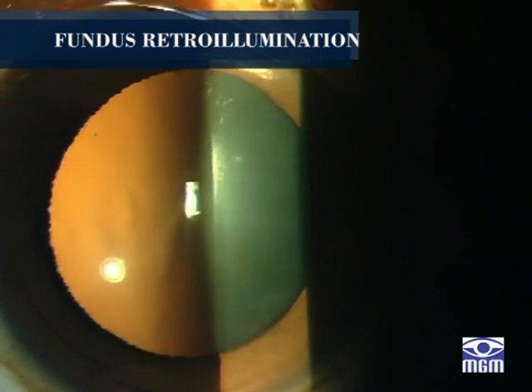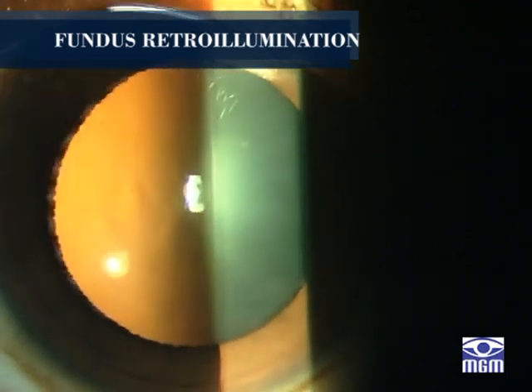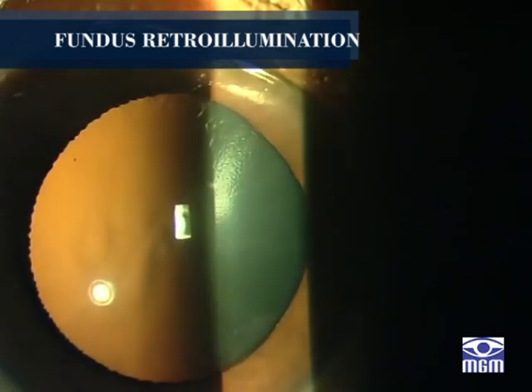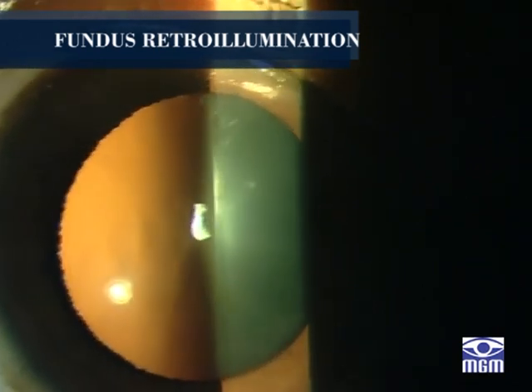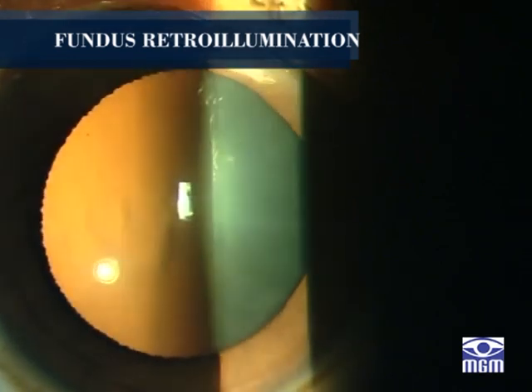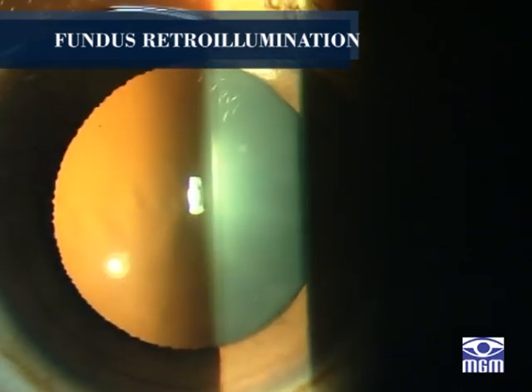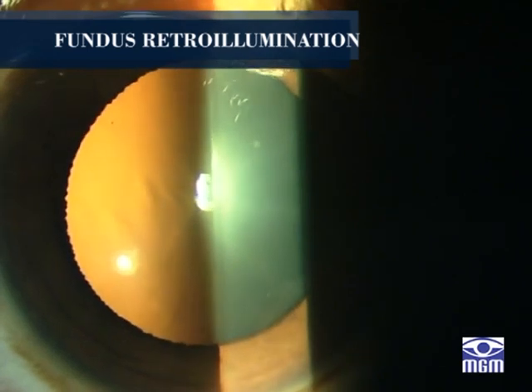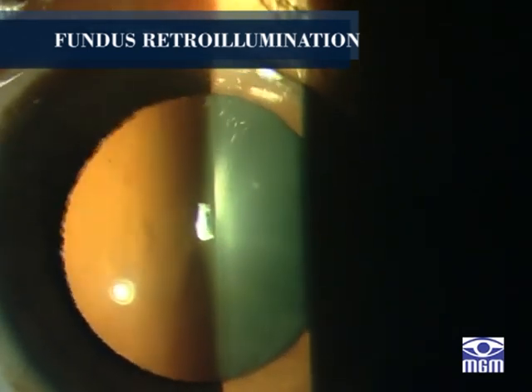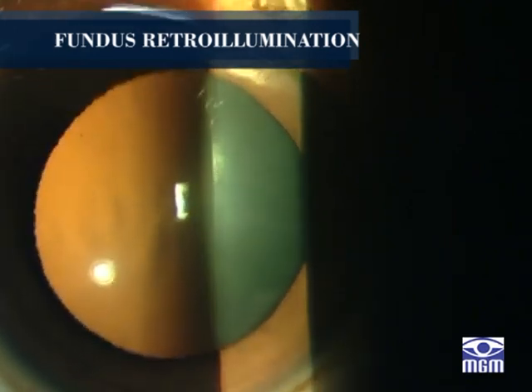With modest excursions of the illuminator to either side of the center, the optimum position is established and the greatest retroillumination effect is achieved. A large pupil is required for maximum effectiveness. After configuring a moderately sized beam, the entire instrument can be moved from side to side to facilitate examination of most of the cornea.